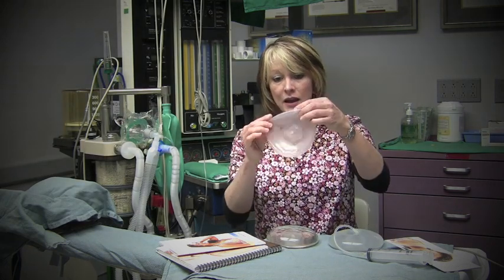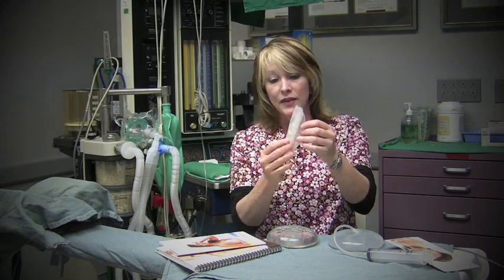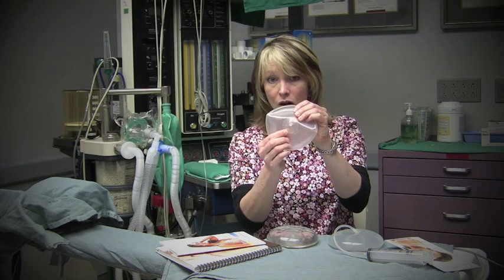This is a saline implant. It comes to us empty, and it's rolled up something like this and inserted and then filled through this valve while it's inside your body. So a saline implant has to have a valve. So now we have two devices in one that can fail. You have the valve that can fail and then the implant itself. And then you add to the fact that it's just filled with basically water, then you've got two primary reasons that the longevity of this device is not as long as a silicone implant is. One, it's filled with basically water, and two, it has a valve that can wear out.